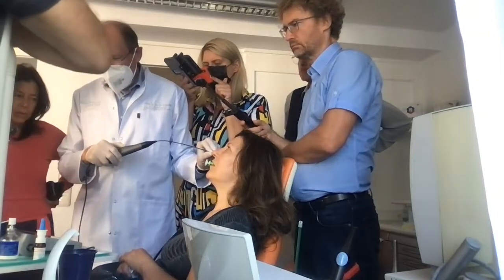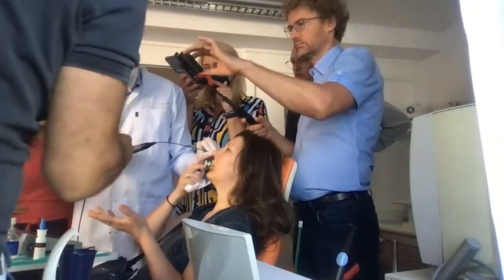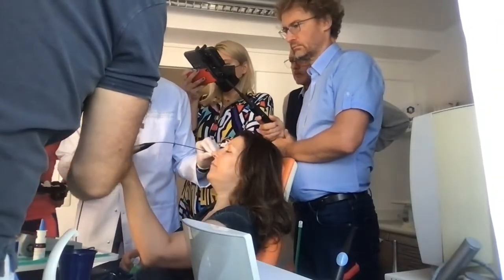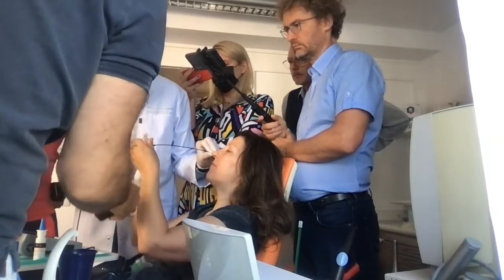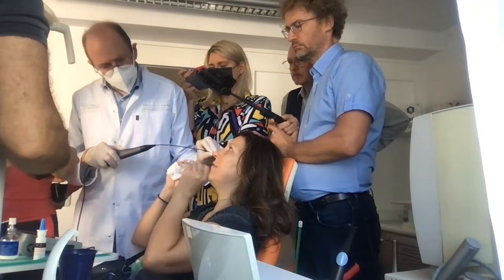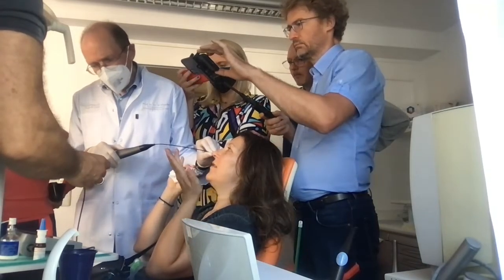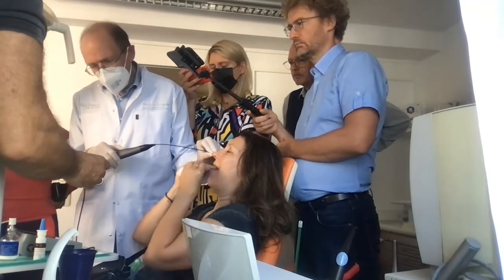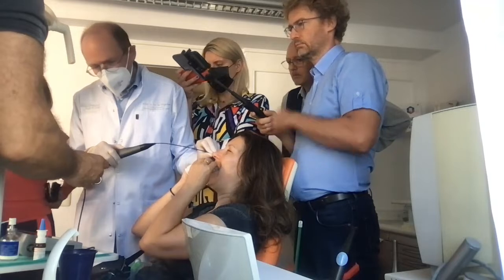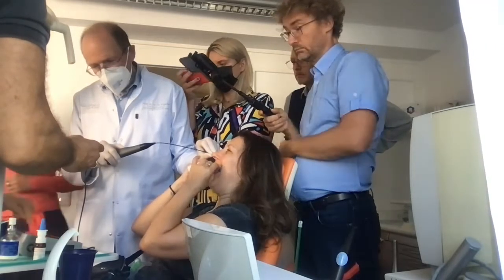I think we are fine. Put a splint, please. Where is the splint? The box. It's still okay? Yeah. All right. Don't forget to ask her to imitate the snore. I can imitate. This is what I do. With the mouth open or the mouth closed? Mouth closed. Okay. I need to fix it.